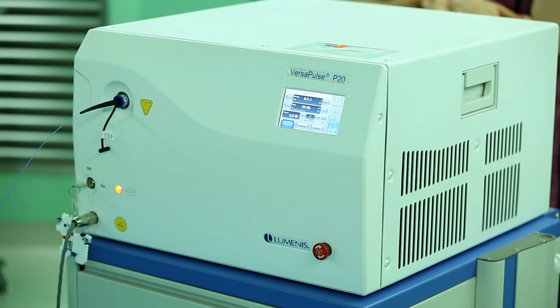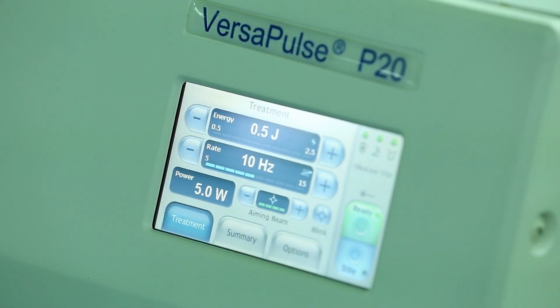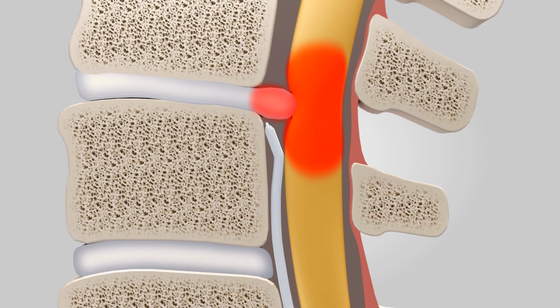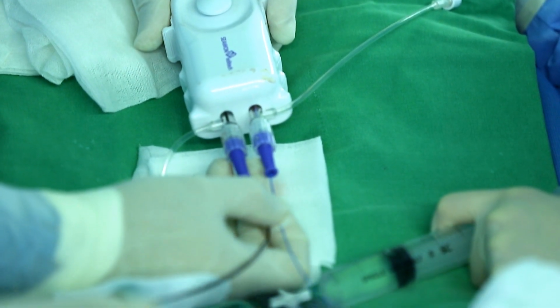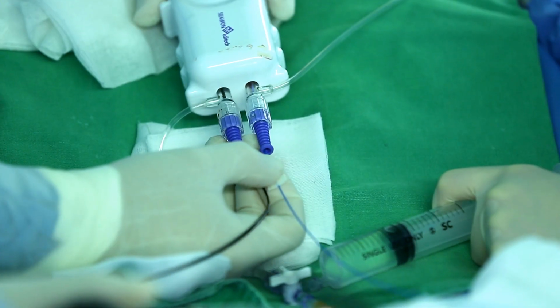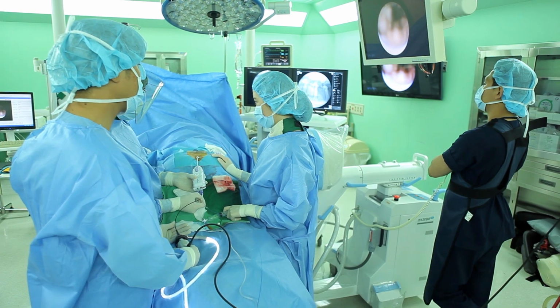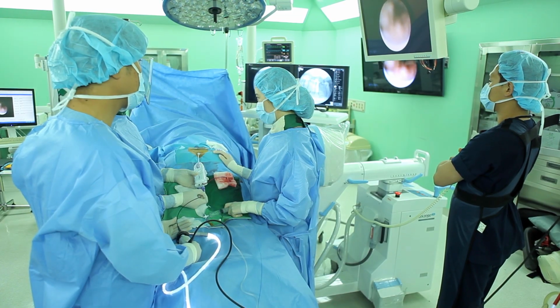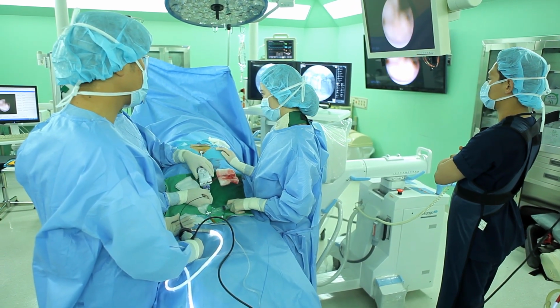If the disc is located near the nerve, you had better fire the laser at 5 watts, not 8 watts. If the disc is much closer to the nerve, you are requested to focus on firing the laser at 2.5 watts to the target point, and you will see a good result. You are requested to fire the laser for as short as 2 to 3 seconds, and to irrigate the saline intermittently for a clean view, preventing thermal injury to the nerve during the lesioning.